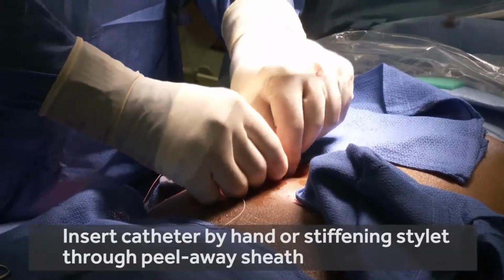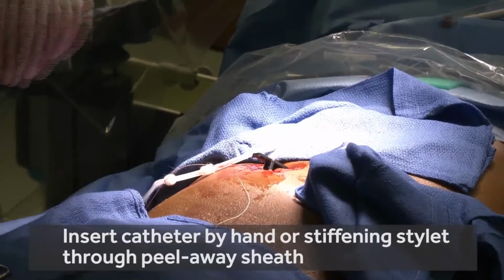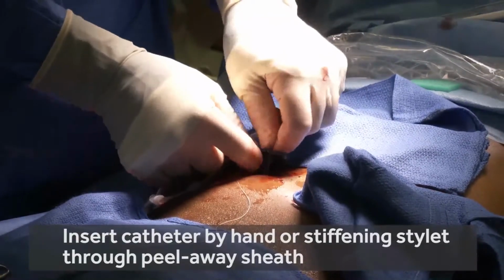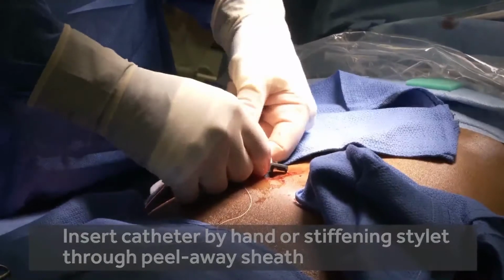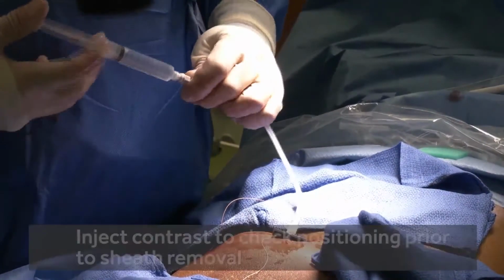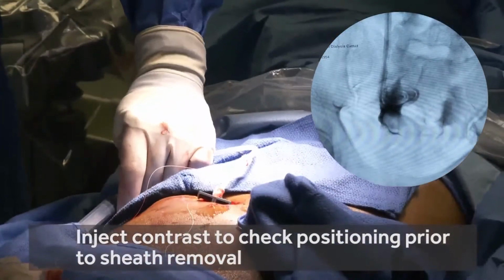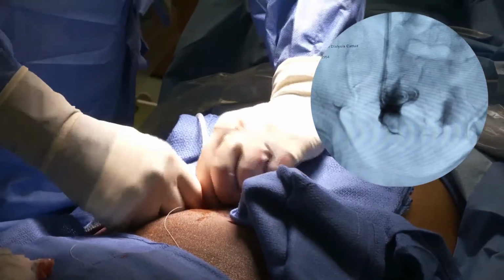And note that we've taken that 2-0 absorbable suture through the cuff, and that will help anchor it internally to the fascia. And this should go pretty much without any resistance at all. Again, we're going to check the position. There's no kinks in the catheter. Good distribution of contrast. We'll remove the peel-away sheath.